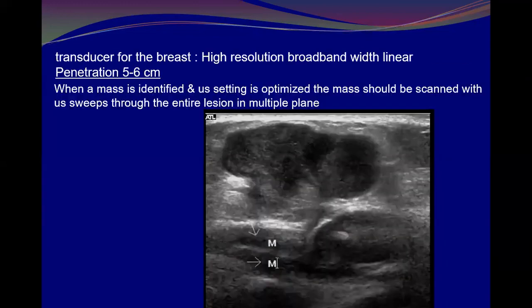And this is another patient, one of my patients. Look at good ultrasound machines with good image optimization. If you had seen the image from the front, you might say this is a fibroadenoma. It is parallel and the anterior margin is so smooth.